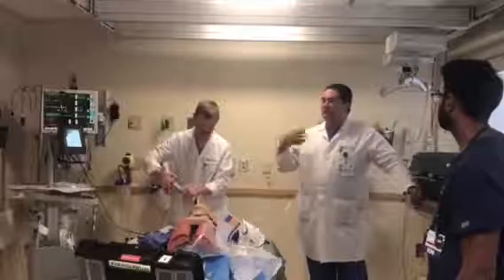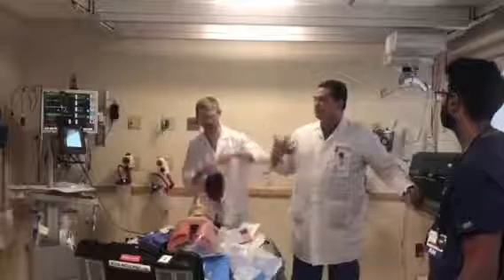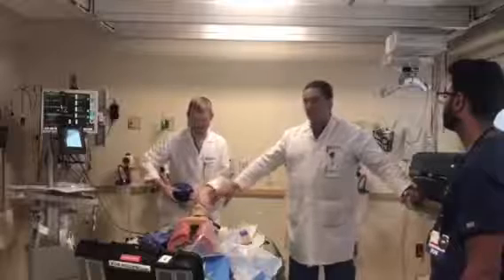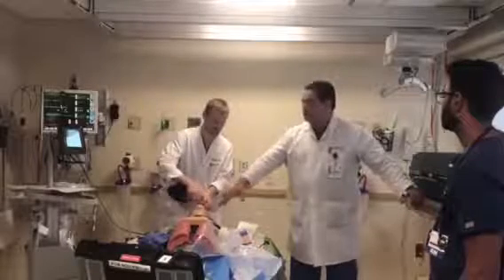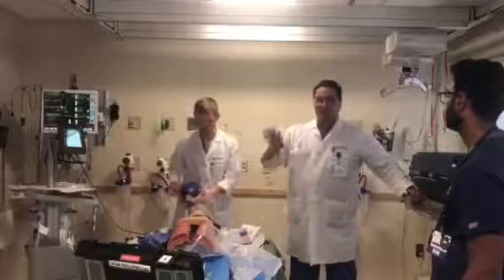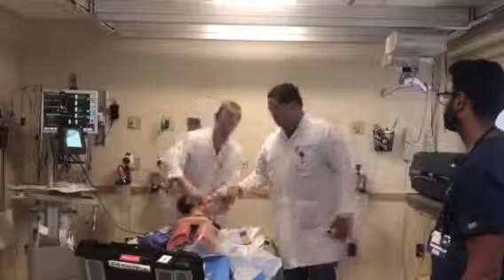So I've made this mistake a million times. You put this in and you quickly want to just go for the tube because you're so revved up. Calm everybody down, put the CO2 detector first, ventilate the patient, give him oxygen, control the situation, calm everybody, don't worry, the patient is going to survive. Now let's intubate the patient, okay?